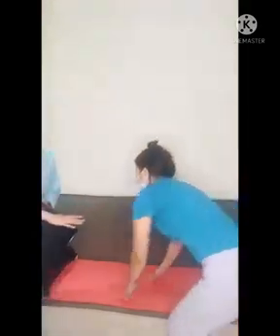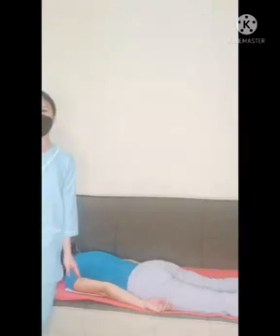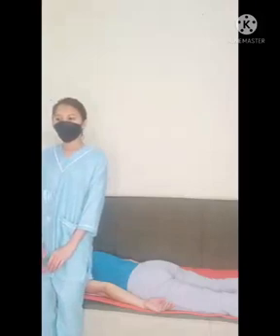What we're going to do next is the SC joint PA oblique projection. We're going to use the 8x10 lengthwise. The patient is placed in the prone position facing the image receptor. So, we're going to put our image receptor, and the hand of our patient is at the back. The hand is placed at the side of the body with palm facing upward. Adjust the shoulders to lie in the same transverse plane.